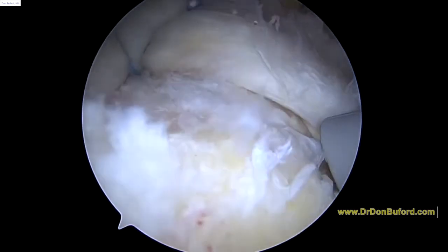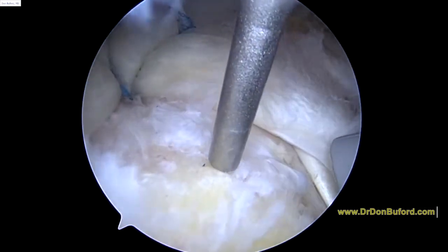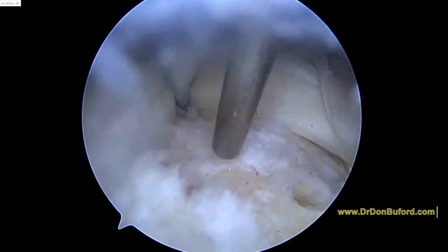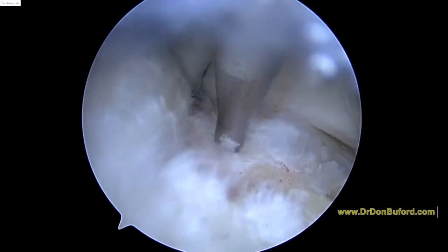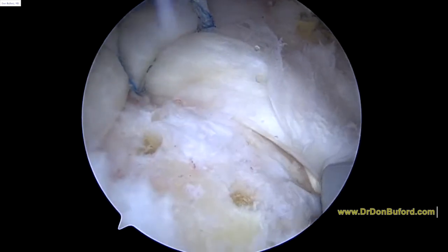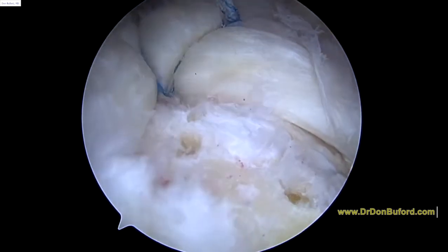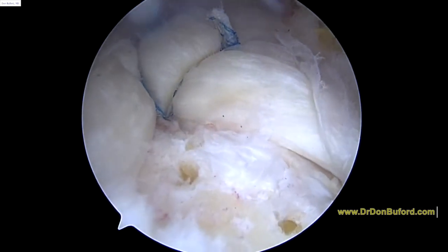There's one, and then we'll do another one over here. What that does is it releases the bone marrow — sometimes when we use stem cell injections, that's all we're doing: getting bone marrow and concentrating it. So there we've got three holes. When we turn down the pressure, you can see it looks like fat starts to come out of those holes — it's actually bone marrow and all the good things that are in it. We're going to finish up here and get you back to the recovery room shortly.